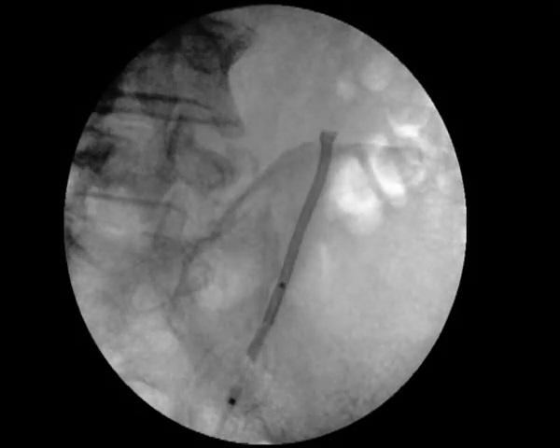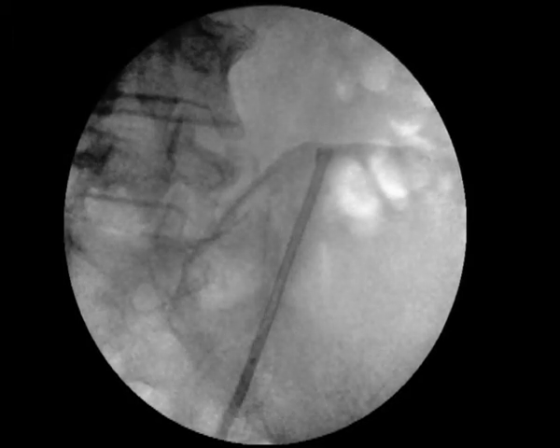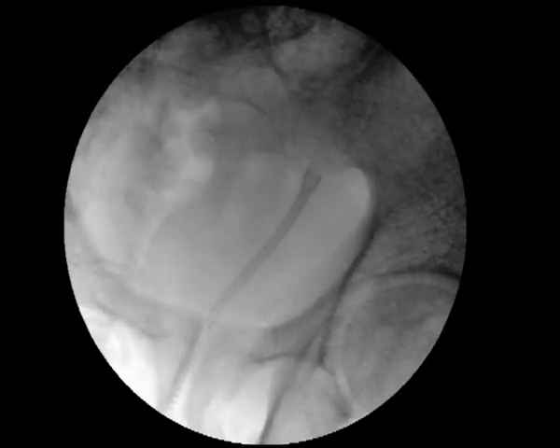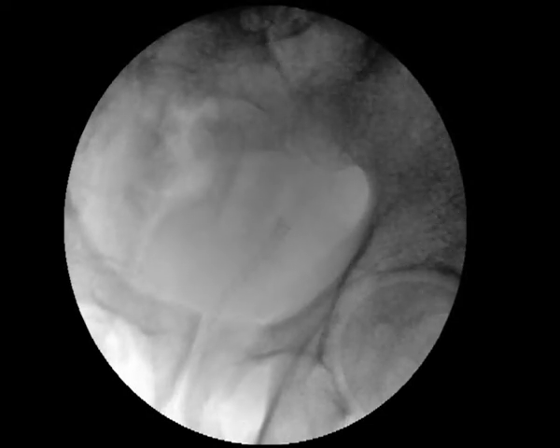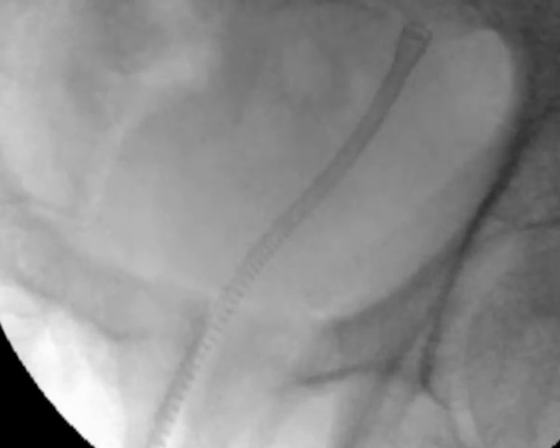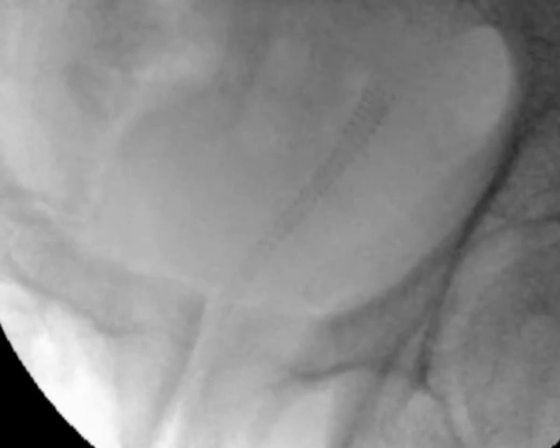After an injection of cold water, the softened stent first stretches and then completely uncoils whilst being pulled out with the balloon catheter. This uncoiling into a thin wire allows atraumatic, minimally invasive removal of the Memocat.